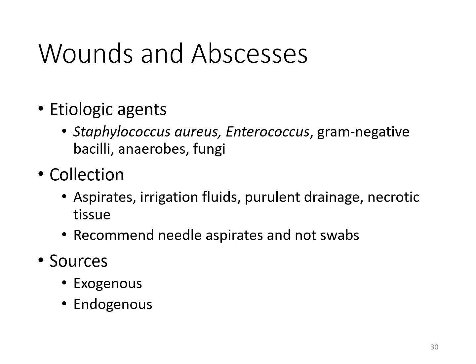The specimen could be collected via an aspirate, collecting the fluids, the drainage, the tissue. You sometimes may even get, if they've done surgery on, let's say, a diabetic patient who is starting to lose the pinky toe or something, a situation where you get a whole toe or a whole limb in the lab to work up and do those cultures.